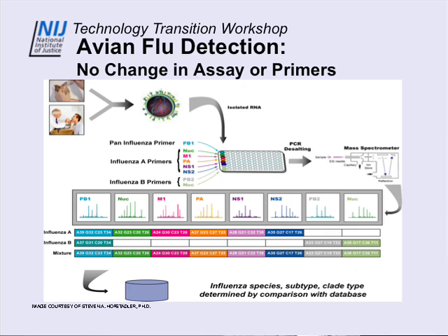Without any change to the assay or the primers, basically the difference is on the clinical specimens we're swabbing the throat of a human, and on some of these avian ones we're swabbing the back end, the cloacal opening of a bird. But everything else is the same.